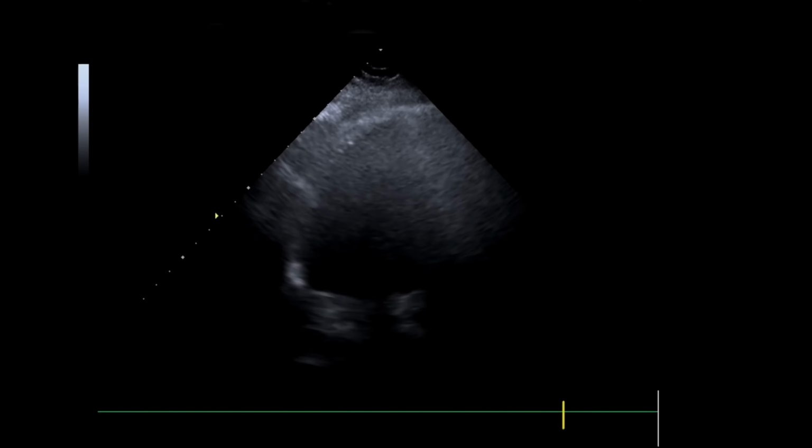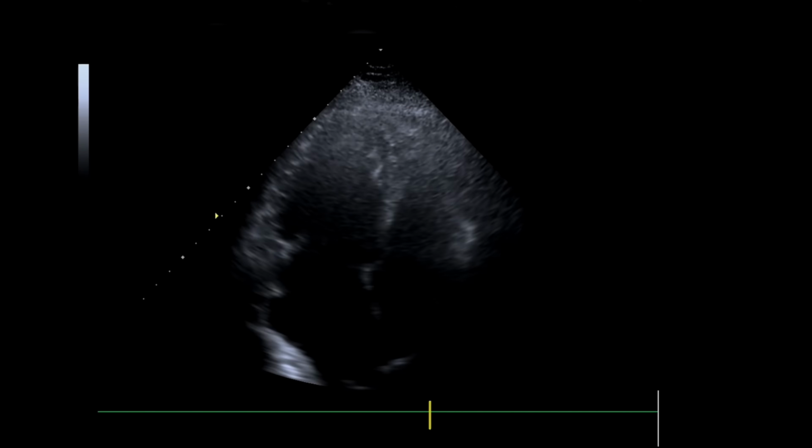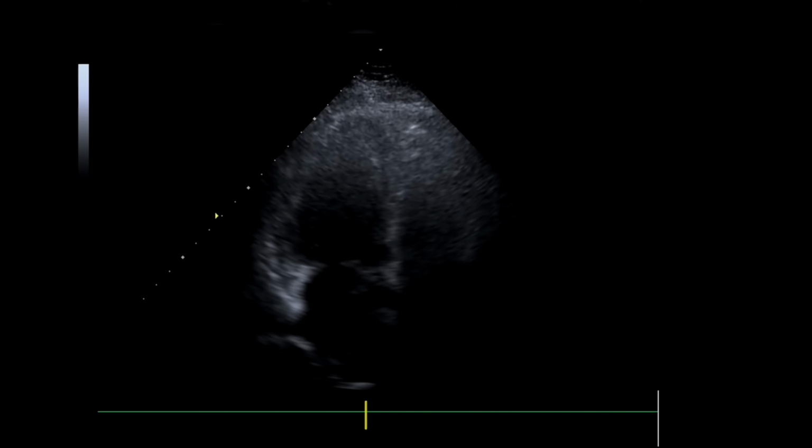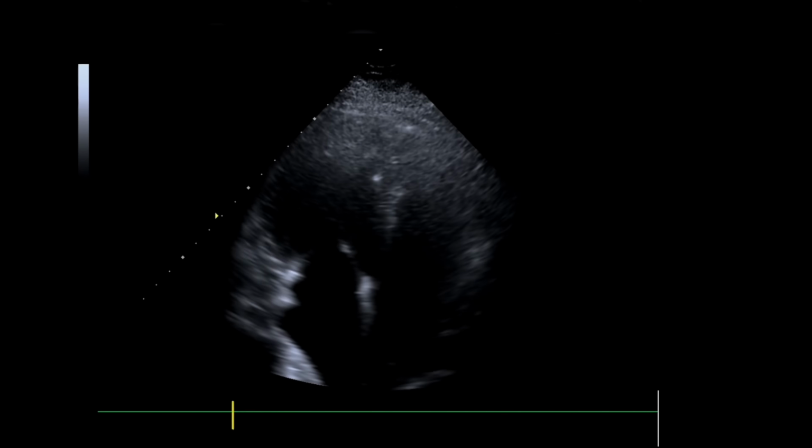So there's no guessing. We have great imaging of the heart, so we can look at structure. We can see, do you have a leaky valve? Do you have a narrowed valve? How leaky, how narrow? Is it to the point where we actually need to do something with this? If you've had a big heart attack, how big? Is it so big that you meet criteria for us putting a little defibrillator inside, something that's going to shock you out of a lethal heart rhythm? So echo provides a whole host of information that helps guide us.